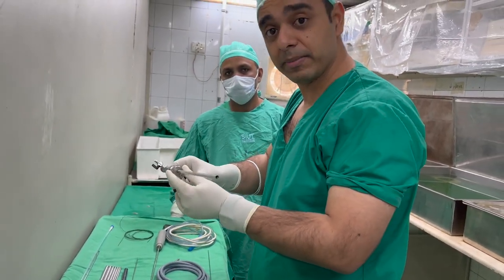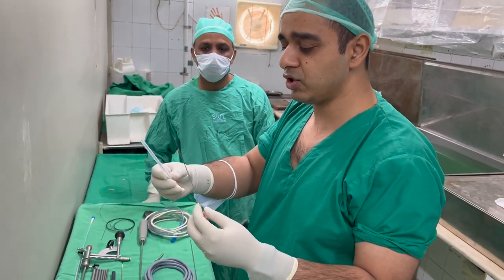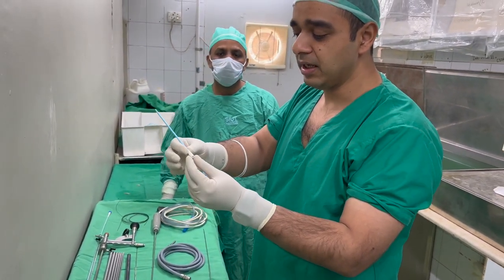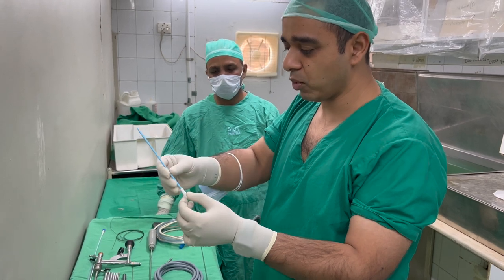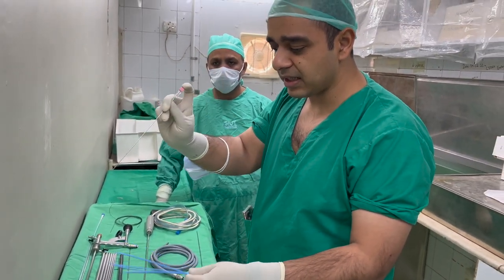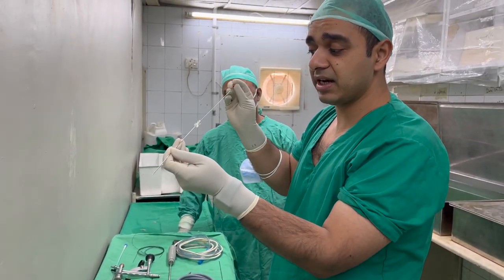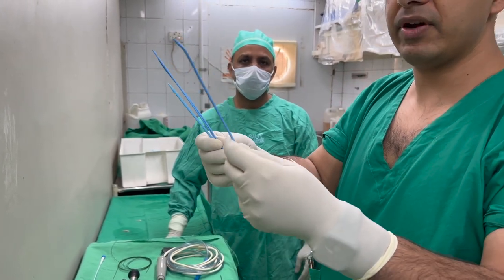Now we will be discussing PCNL — the nephroscope and PCNL. First we need a needle — we have the LP needle and Chiba needle. There is also a Amplatz needle which has a double end so you can remove it, check the water, and place it further inside. After placing the Chiba or LP needle into the calyx following a retrograde study, urine or water starts coming and then you place a guide wire into the kidney. After guide wire placement we put these fascial dilators inside and make a track. After dilating to 10 FR we place the central rod — this is the central rod, also called an olive.